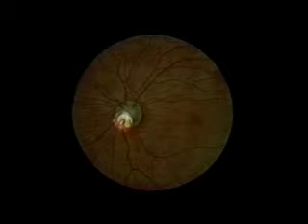Note any opacities that interrupt the red reflex. While holding the red reflex in view, approach the patient's eye along a 15-degree line lateral to her line of vision until the ophthalmoscope is close to the eye. Try to find the optic disc by following the retinal vessels toward the place where they converge. Now bring the optic disc into sharp focus by adjusting the ophthalmoscope lens.